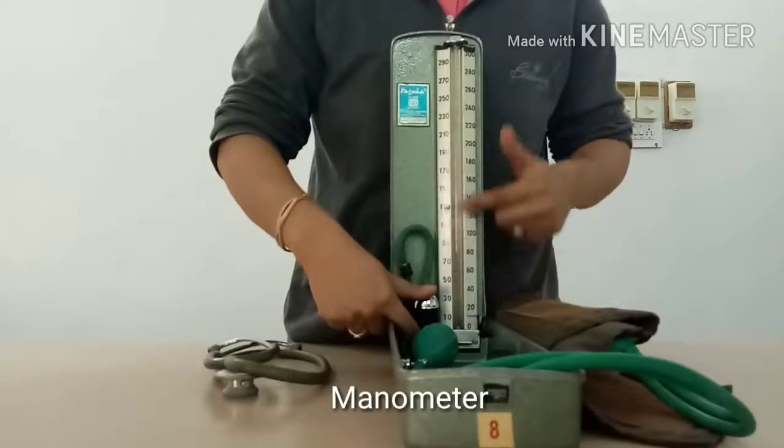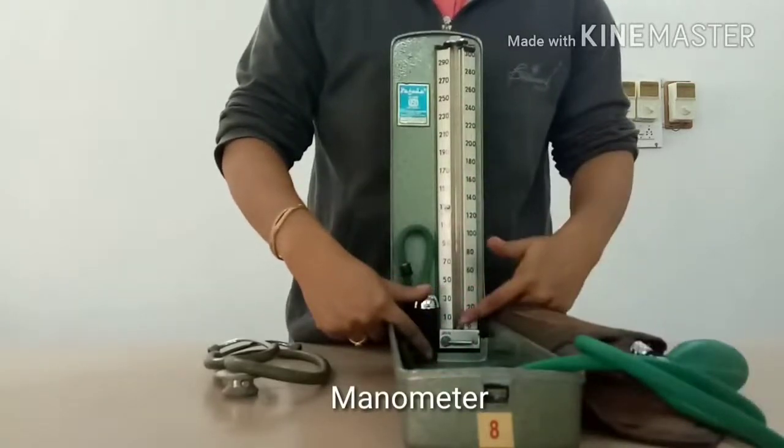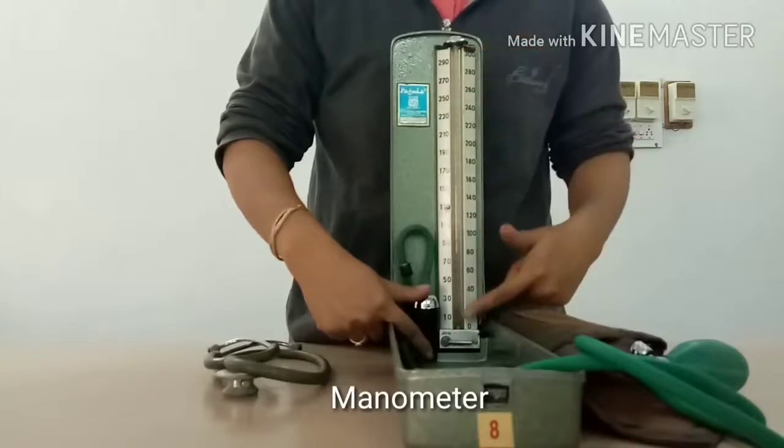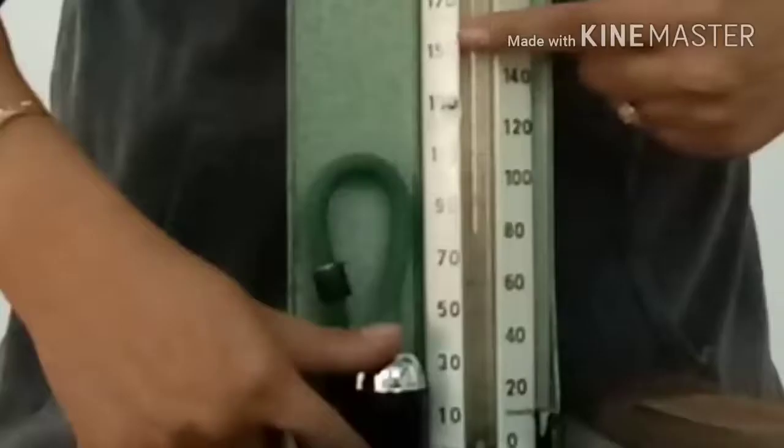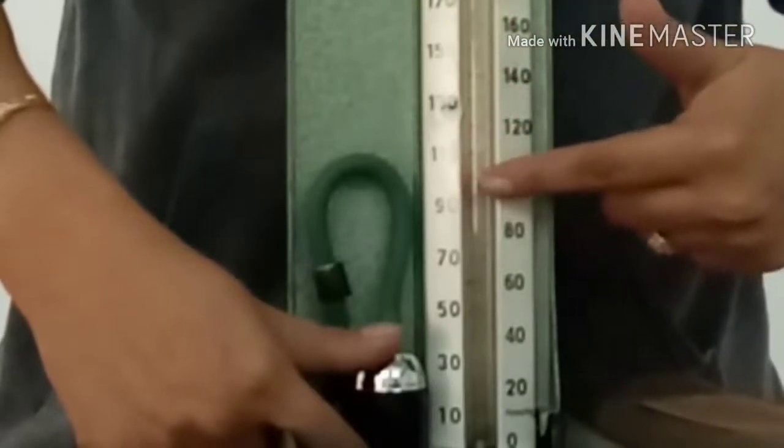The broader limb is the reservoir for mercury and the narrow limb is graduated from 0 to 300 mm with the smallest division corresponding to a reading of 2 mm of mercury.